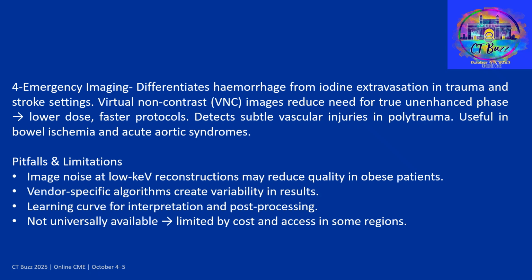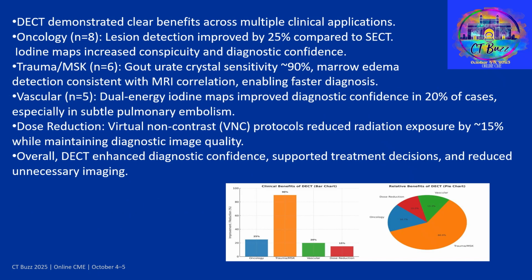There are some pitfalls and limitations also. Image noise at low keV reconstructions may reduce quality in obese patients. Vendor-specific algorithms create variability in results. Learning curve for interpretation and post-processing, non-universal availability. In our study, dual energy CT demonstrated clear benefit across multiple clinical applications.